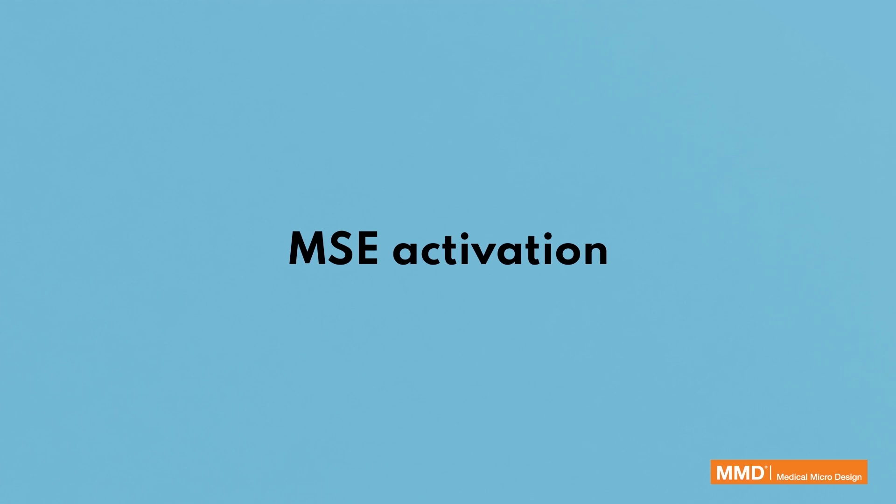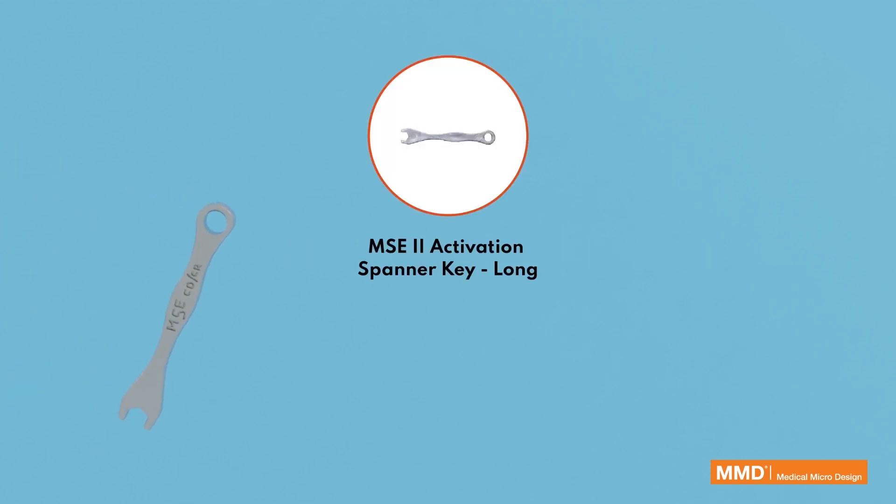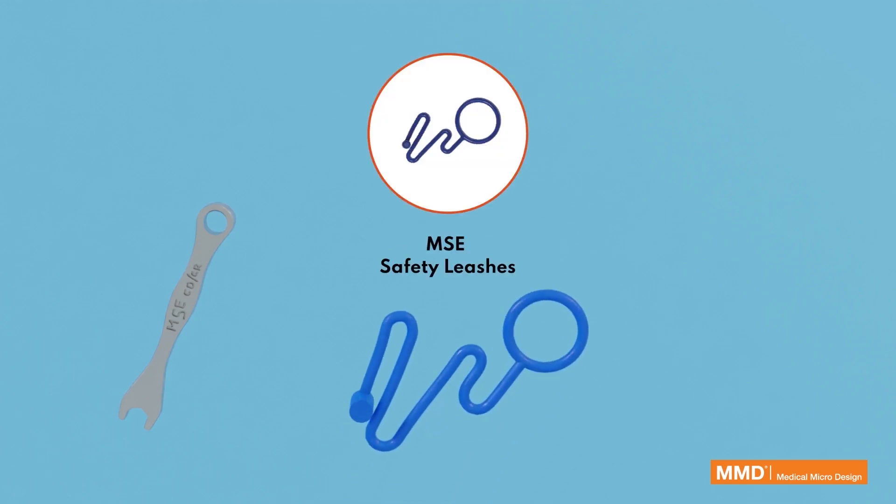MSE activation is performed using the MSE 2 Activation Spanner Key Long. MSE safety leashes should be in place during activation.